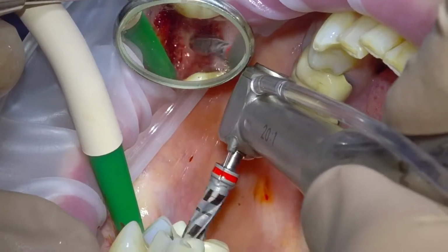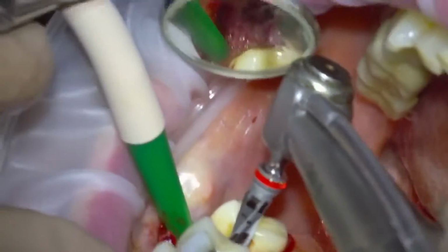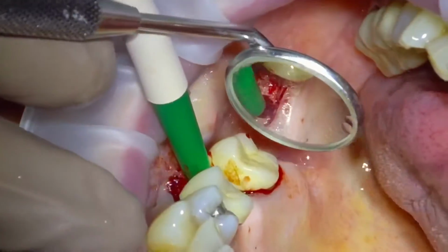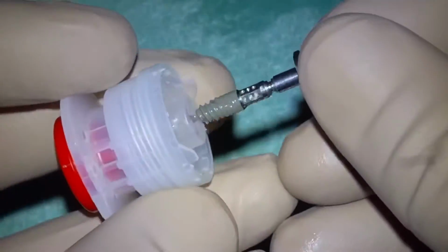And then this is the final drill in the sequence. We notice we're going straight line access, straight in, straight out. Down to depth, we just check to see that there isn't a perforation.